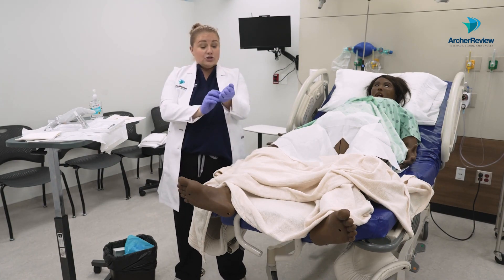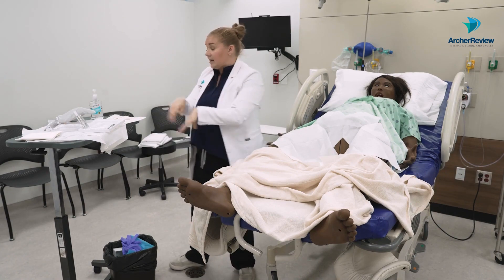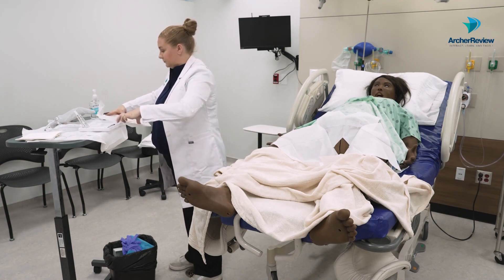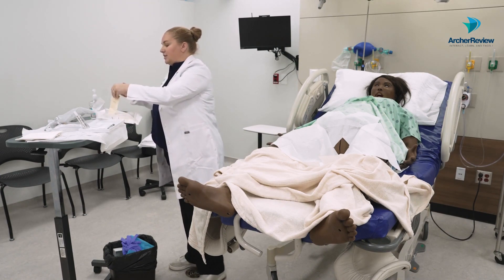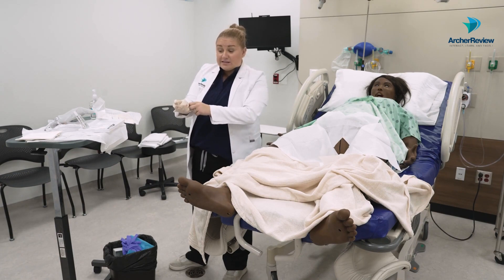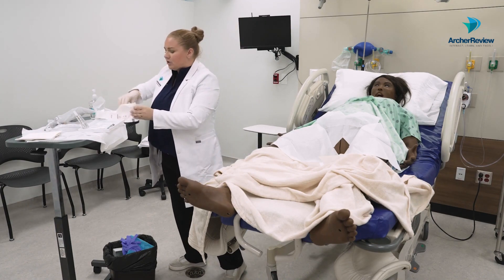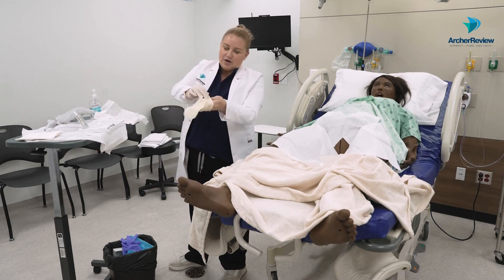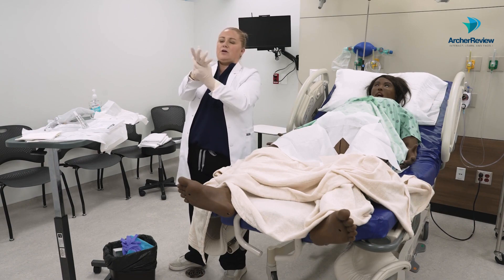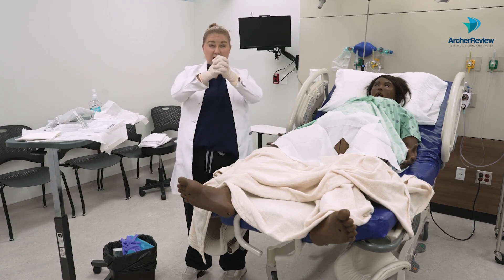Let's now doff our clean gloves so that we can get sterile. Hand hygiene again. Let's open up our sterile gloves — I usually do my right hand first. I should note that Foley trays usually come with a pack of sterile gloves, but they may not be your size, so go ahead and check that. If you need an extra pair like I do, grab those in addition to your other materials. Got that on — now I am sterile. I do not want to touch anything on my sterile field until I am at this point.